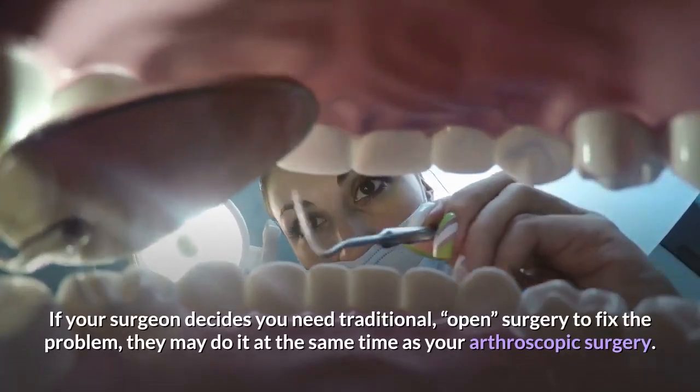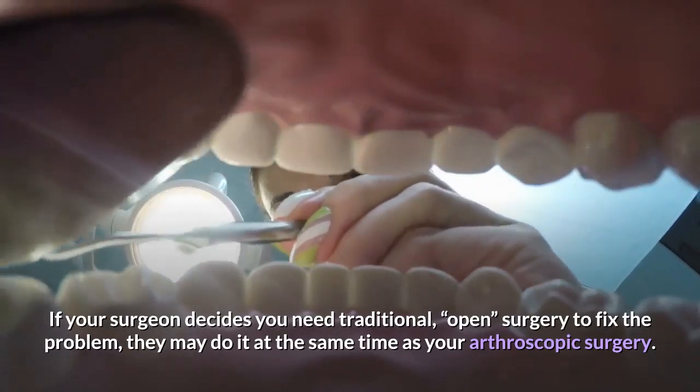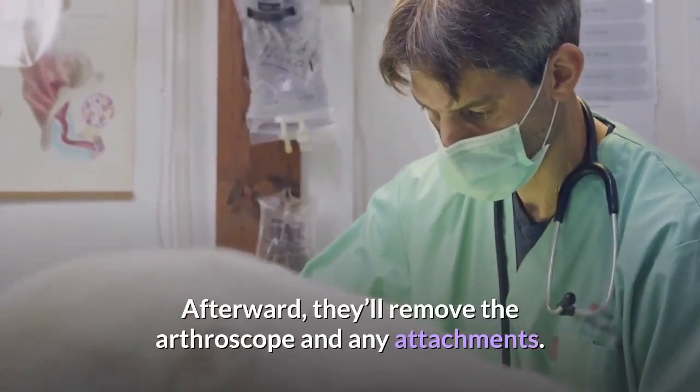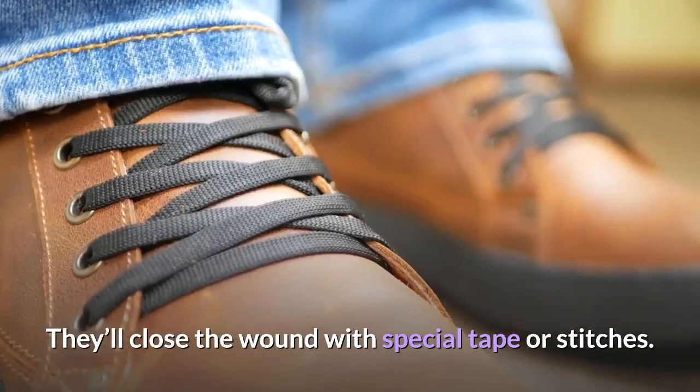If your surgeon decides you need traditional, open surgery to fix the problem, they may do it at the same time as your arthroscopic surgery. Afterward, they'll remove the arthroscope and any attachments, and close the wound with special tape or stitches.